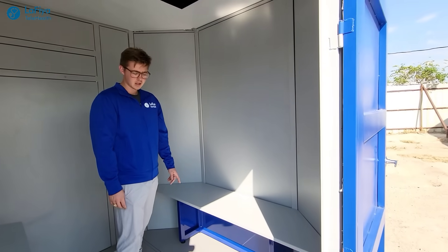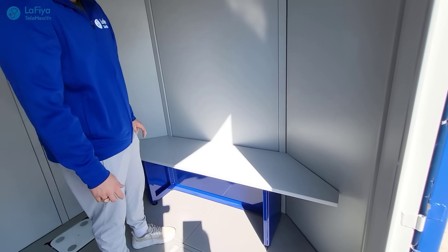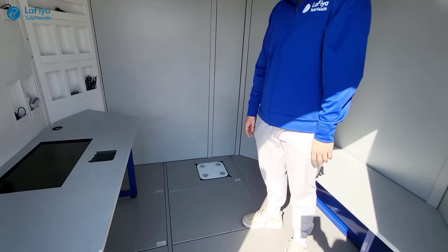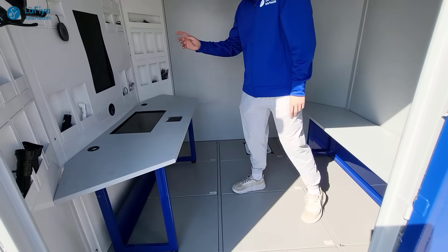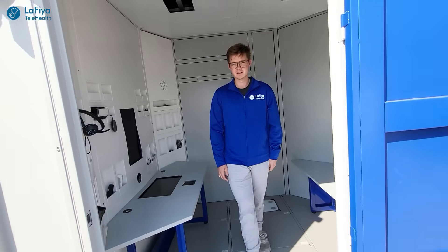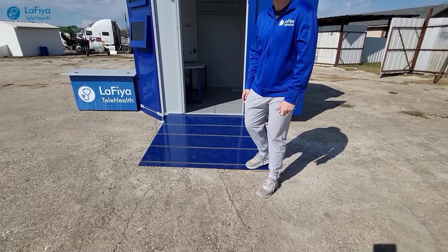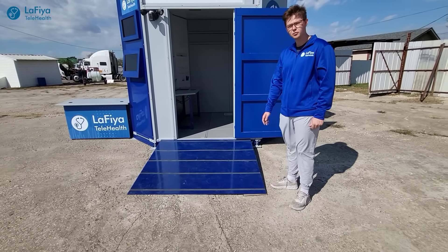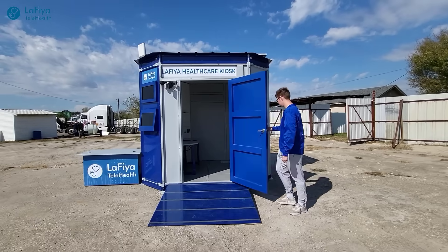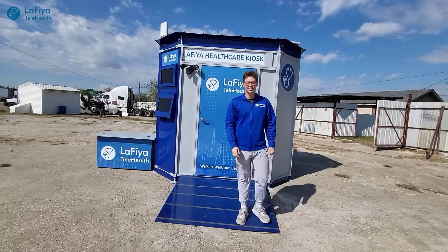There's a back bench here for anyone that might accompany the patient during their visit. There will also be a chair here for the patient to sit in to clearly see the doctor and also clearly portray themselves to the doctor through the camera. Lastly, there's a ramp here to help disabled patients get into the kiosk comfortably and safely. That is all — this is the LaFiya TeleHealth Medical Kiosk.